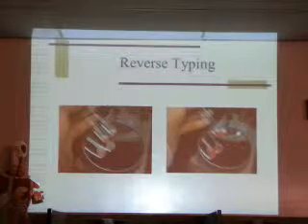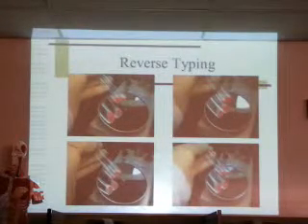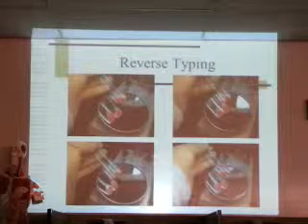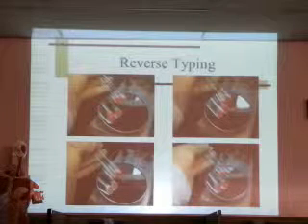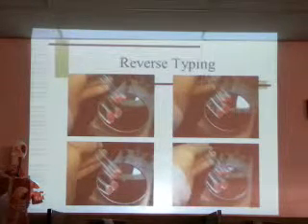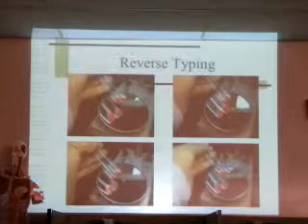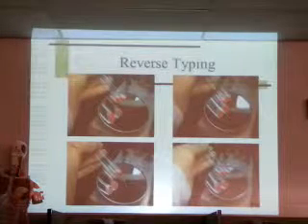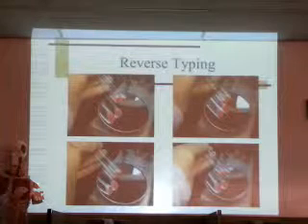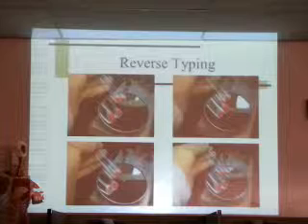Okay, so do you remember who makes anti-B? A individuals make anti-B. So let's see if we can identify the groups. No agglutination with A, agglutination with B. This person's an A. A individuals make anti-B, so our B red cells are going to agglutinate. Agglutination with A red cells, no agglutination with B red cells. Who makes anti-A? B individuals. There's agglutination with A, and it looks like there's a weak agglutination with B. So if both A and B cells agglutinate, it's an O individual. The O person makes both anti-A and anti-B, because their red cells lack the A and B antigens, so they're going to make antibodies to both.